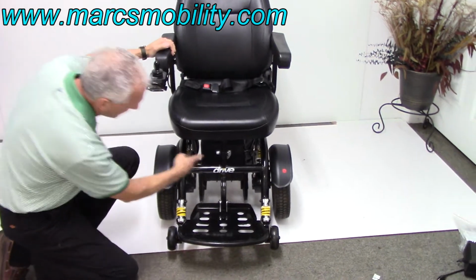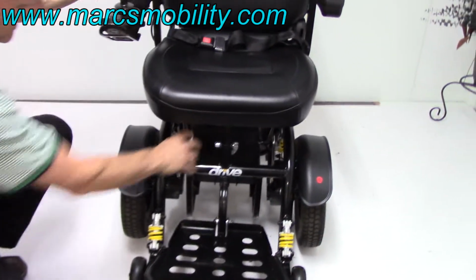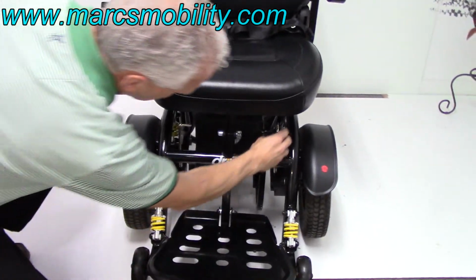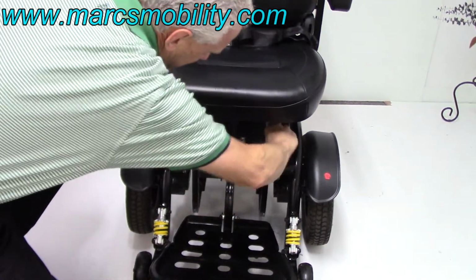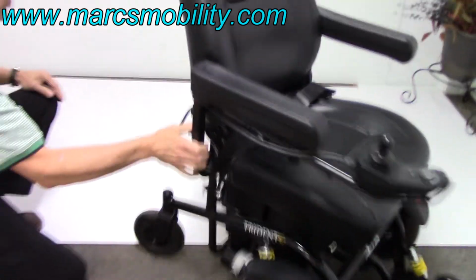And right here in the front of the chair, you got 2 levers. If you turn those levers towards the inside, you can see this wheel's already unlocked. Turn the lever towards the inside, and now this is a very easy chair to push around.